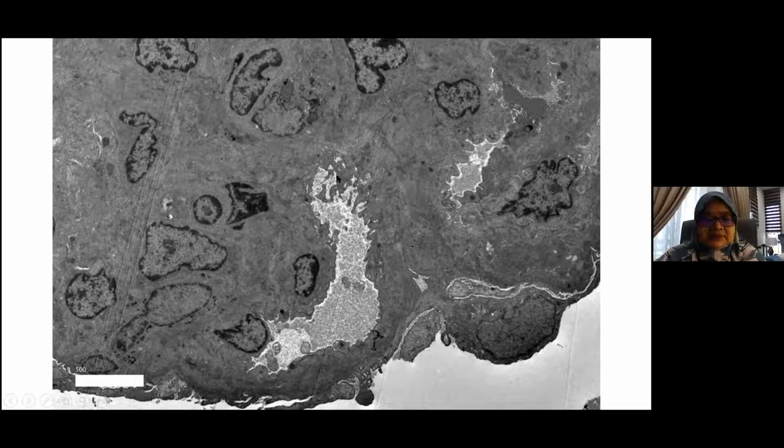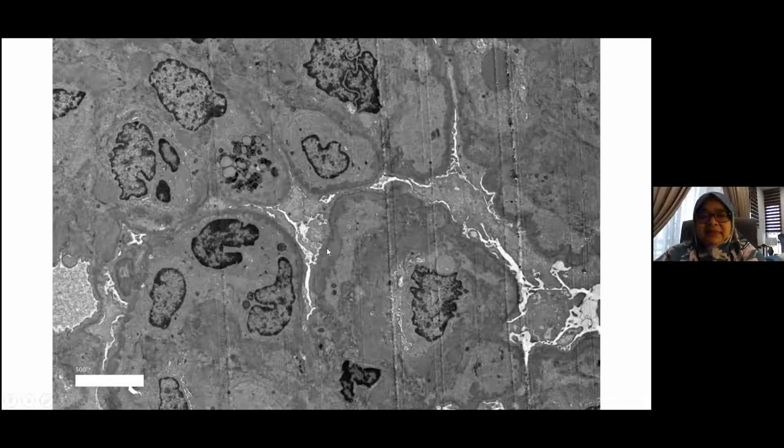And this is the mesangium having increased mesangial cellularity. Okay, this is a better picture, hopefully. So you can see that there are a few loops. Okay, so this is probably a clearer loop to you. One capillary loop, this is another capillary loop, another one. So there are a few capillary loops. Okay, and these are the mesangium.